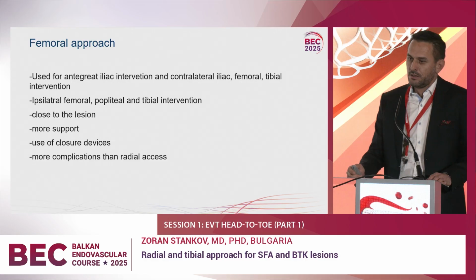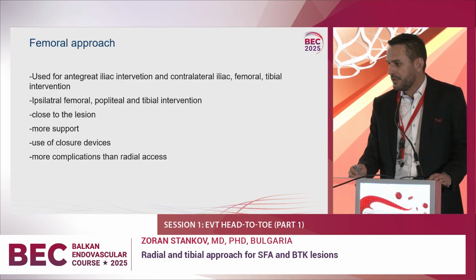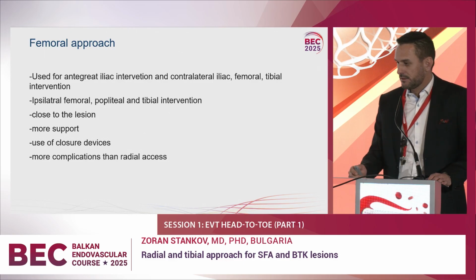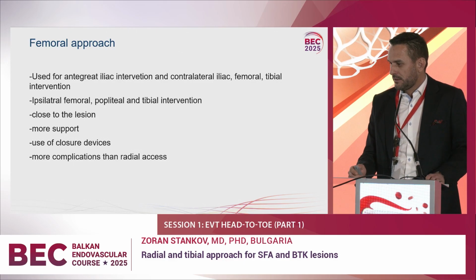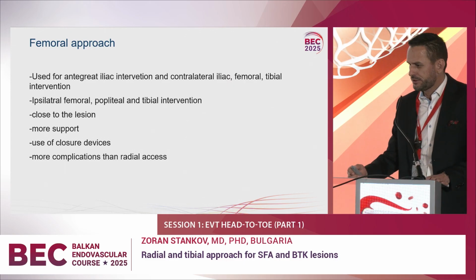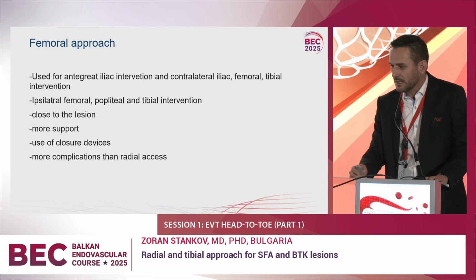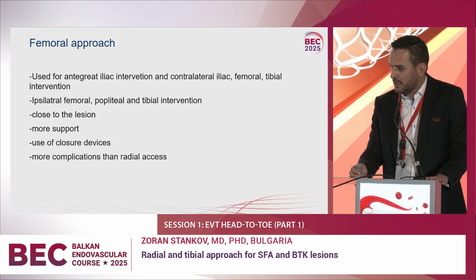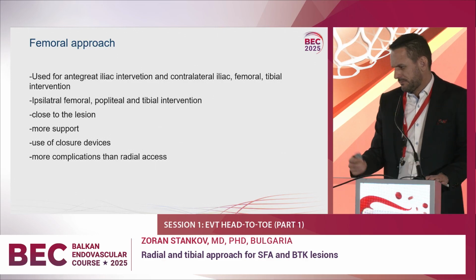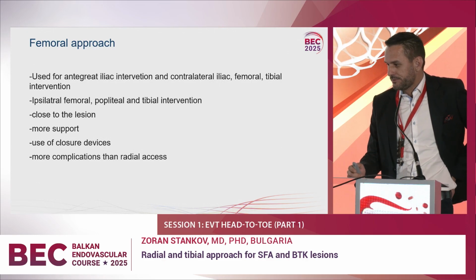The femoral approach is a very good approach for peripheral artery disease because it can be used for the contralateral procedure, for iliac intervention, femoral tibial intervention, and ipsilateral popliteal and tibial intervention. It's very close to the lesion, and this gives us more support for calcification and for device crossing of the lesion.